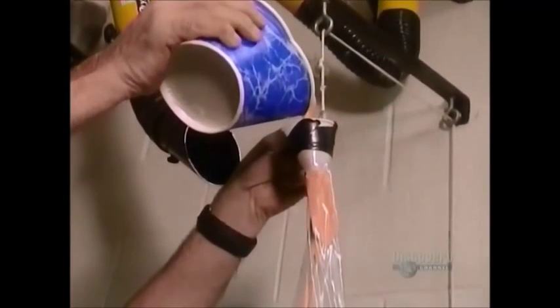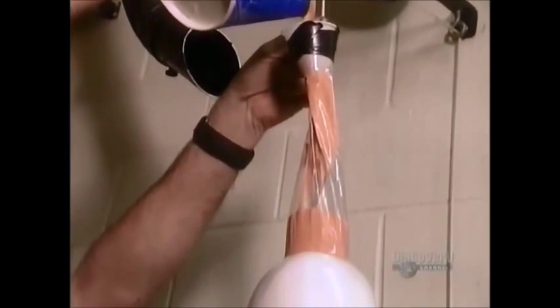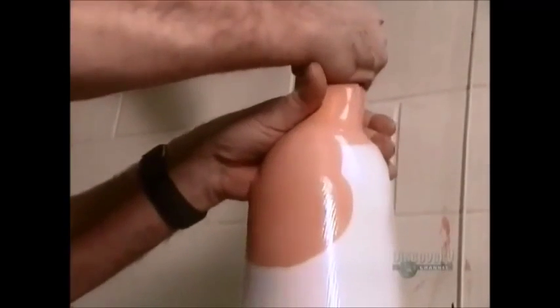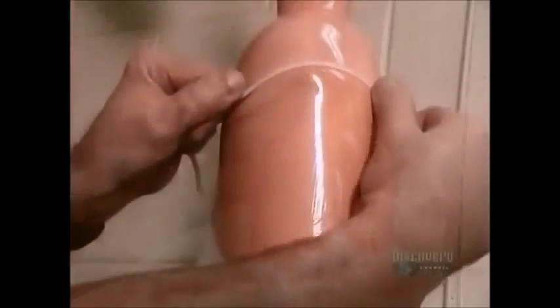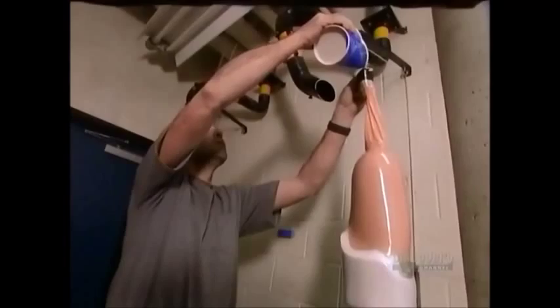Then they coat the socks with a liquid resin made of either polyester or acrylic. Here, they are using acrylic tinted to look like Caucasian skin. It's important to ensure the surface is evenly soaked — a meticulous process that takes about an hour. The acrylic solidifies in about an hour; polyester takes about 12 hours. They then break the plaster mold inside, leaving a durable plastic shell called a socket. That will be the basis of the artificial limb.